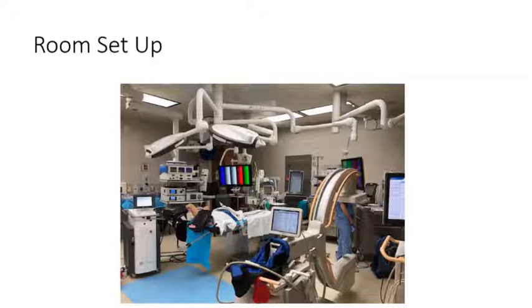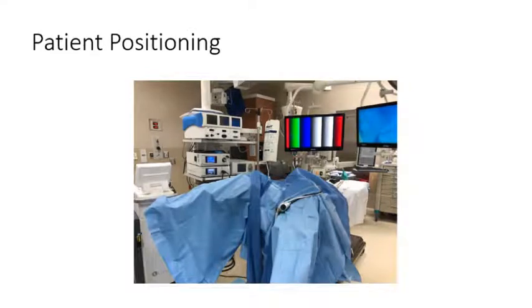To protect the operating room personnel, there is a highly absorbent floor mat placed to prevent accidental spills of irrigation fluid. It is critical to make sure that the patient is well padded at the level of pressure points, including the knee and the ankle, as well as taking care of the fingers. This can be accomplished with foam pads. Here is a patient who has been appropriately placed in dorsal lithotomy position and well draped, making sure that all of the cords are placed onto the patient without having any pressure points on the patient.